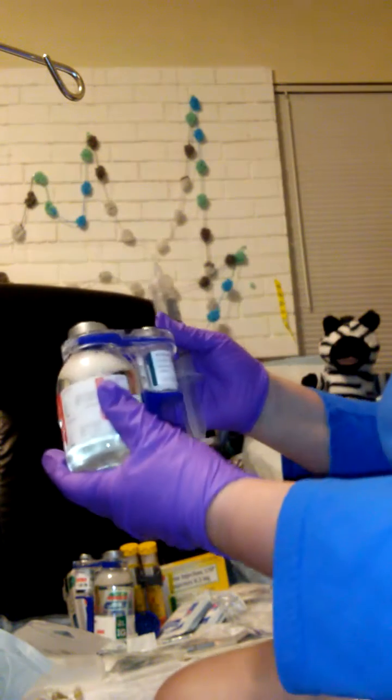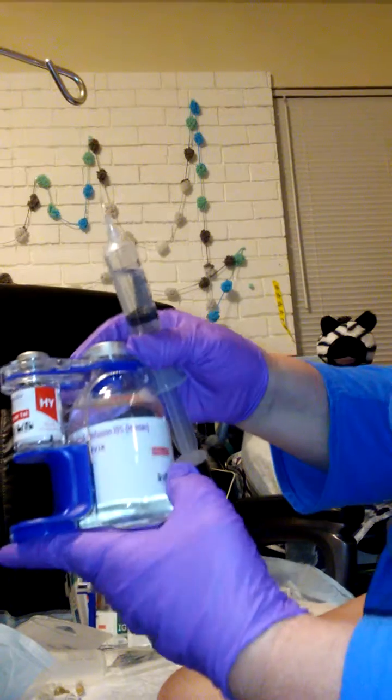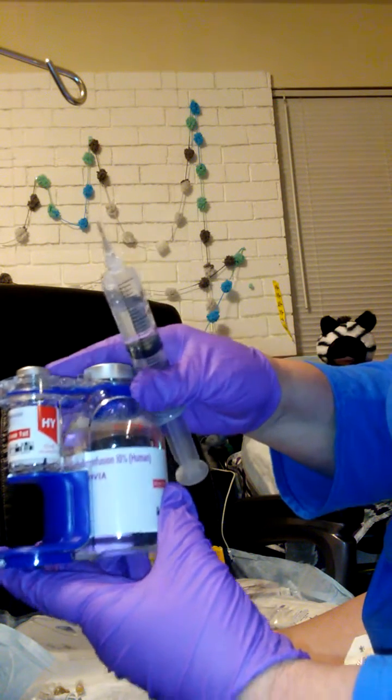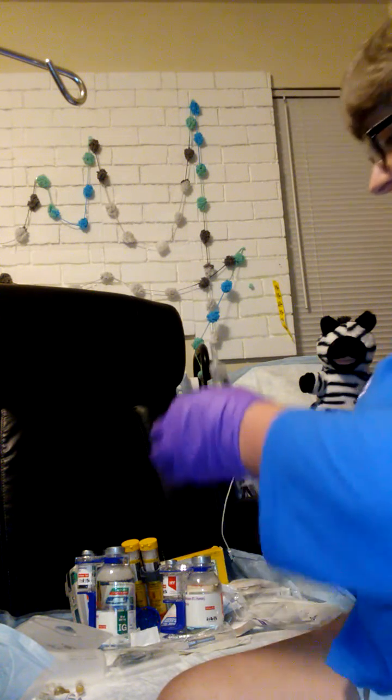And that's the only one. It says here, infuse first. So that's coming out. This is not being used at all right now. I'm going to set this over here and let it wait its turn.